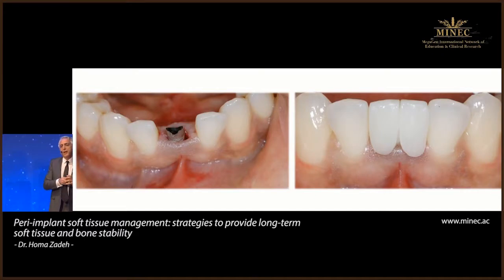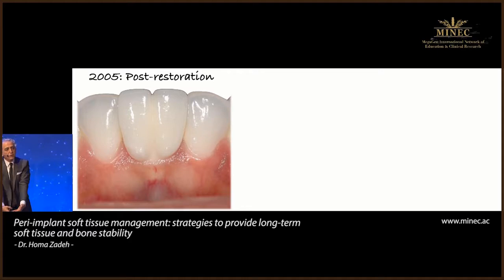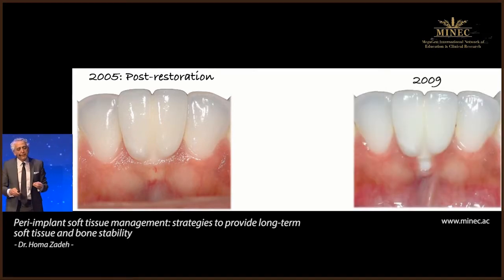An abutment was placed that was kind of narrow in stock. The implant was placed more in the lingual position and created the illusion of a papilla. But when the patient came back from the general practitioner who restored it with a definitive restoration with a zirconia abutment, they made a very thick abutment. So the same thing that we discussed with teeth, if they're prominent, more associated with recession, the same is true with implants. Because soon after, she experienced mucosal recession around the implant.